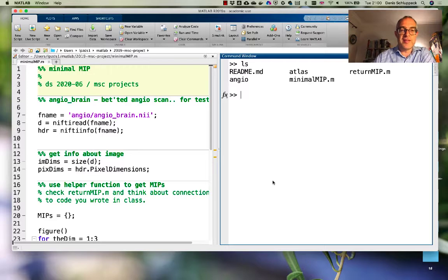But for some analysis, we probably want to move into MATLAB, so it's worthwhile for making figures and so on to also be happy in here. So you have access to this code in the repository. I will show you at some point how to get hold of it if you have any problems, but it should be relatively straightforward.